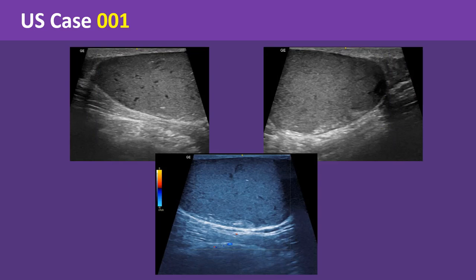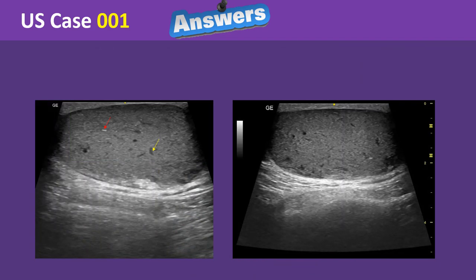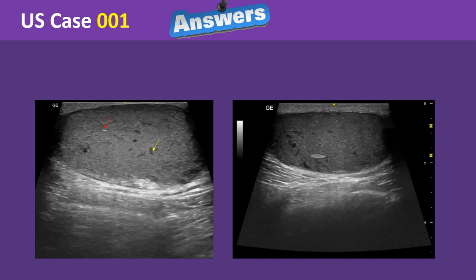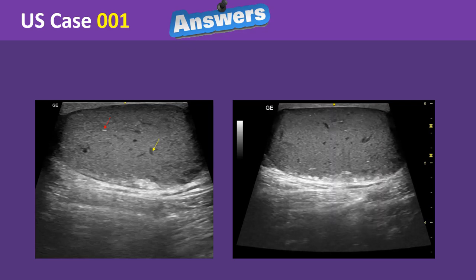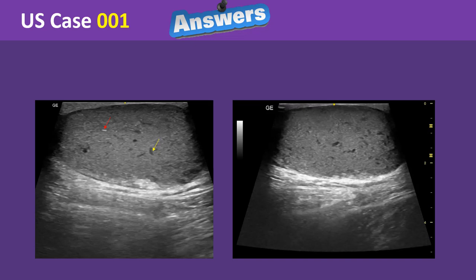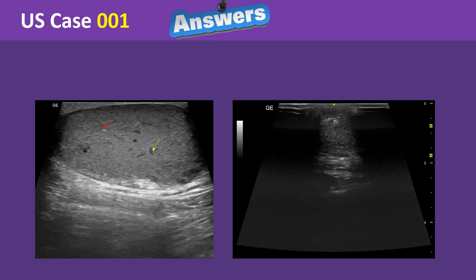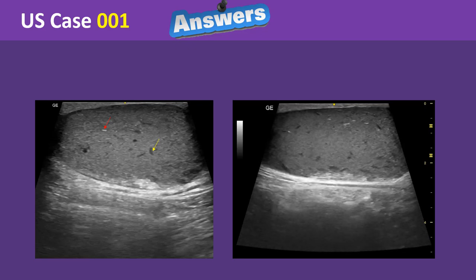This is a grayscale and color Doppler images of the lesion. As you can see on these images, there is a well-defined encapsulated slightly hypoechoic lesion seen in the subcutaneous fat planes, having a broad dermal attachment. It shows a pseudo-testis appearance with a few internal echogenic linear reflectors, rice-like as the red arrow is pointing, and a filiform hypoechoic cleft as the yellow arrow is pointing. The lesion shows posterior acoustic enhancement.